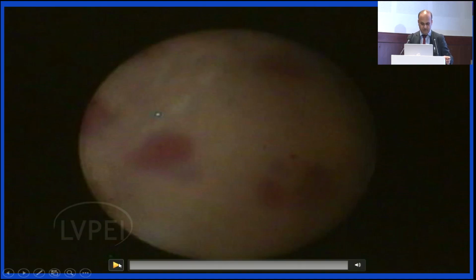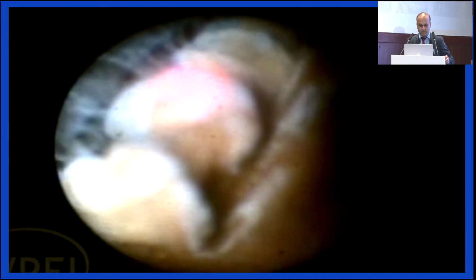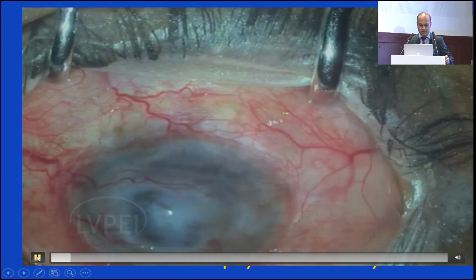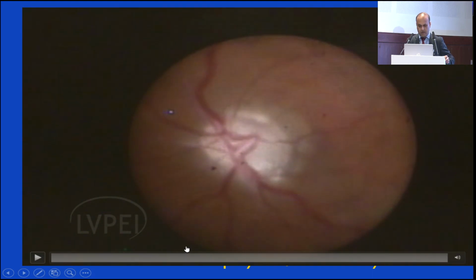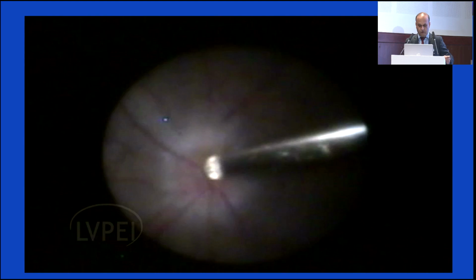This was another one of these cases where we did a diagnostic endoscopy to visualize the optic disc and the macular status. But let me show you some more areas. Assessment of ciliary body structures and peripheral membranes again becomes easy. We were earlier talking about how anterior membranes are such a big cause of PVR, and what endoscopy also does is it allows us to visualize these.